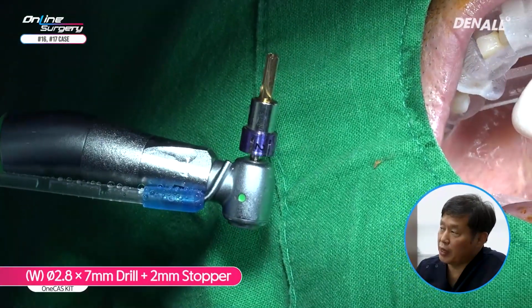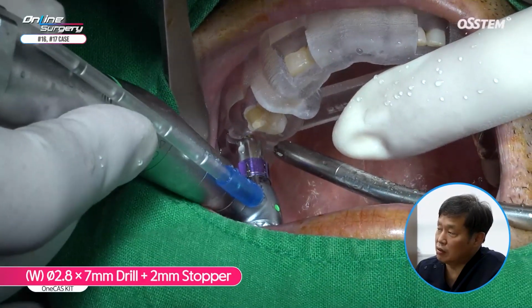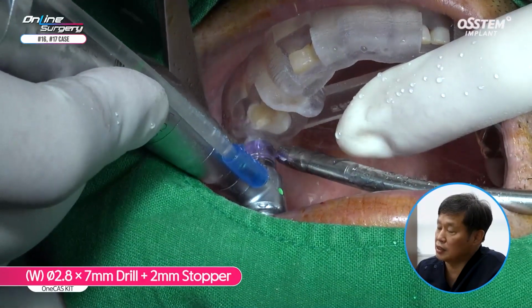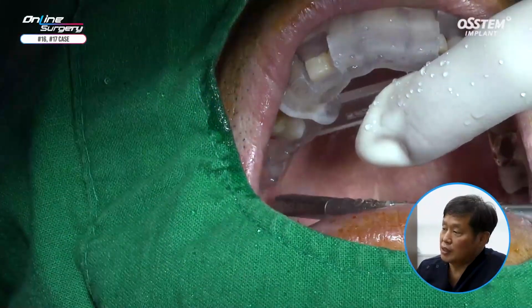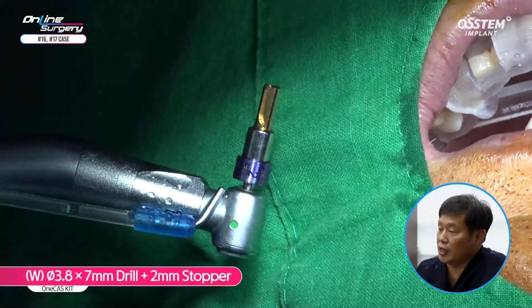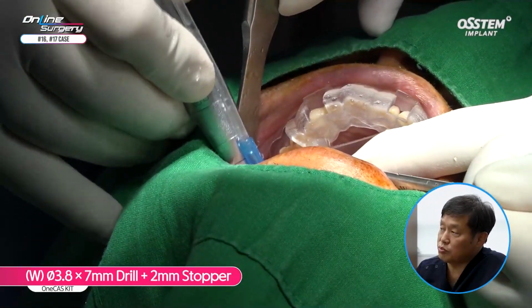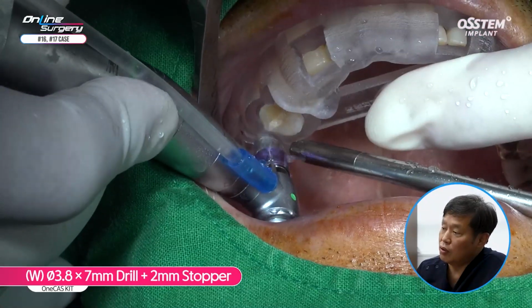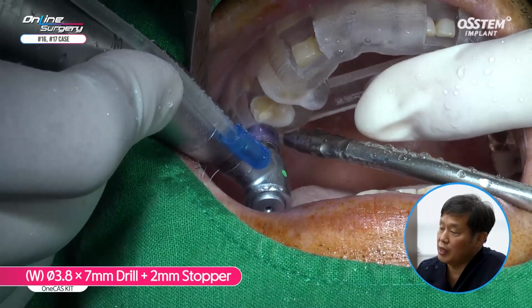2.8 by 7 millimeter drill and 2 millimeter stopper. Drill hole is expanded up to 5 millimeters. 3.8 by 7 millimeter drill with 2 millimeter stopper as mentioned. Because it is upper posterior, I assumed it was soft bone, and final drill was at 3.8 drill.